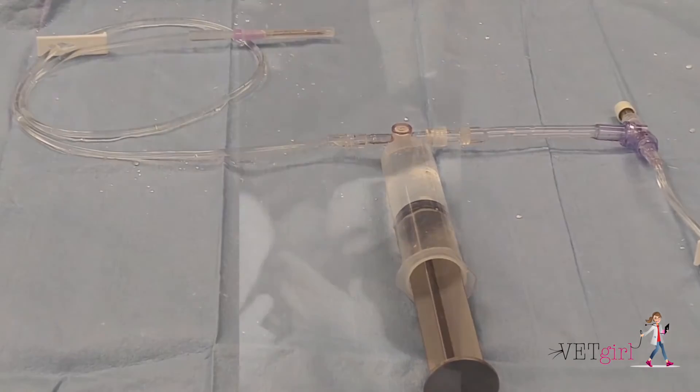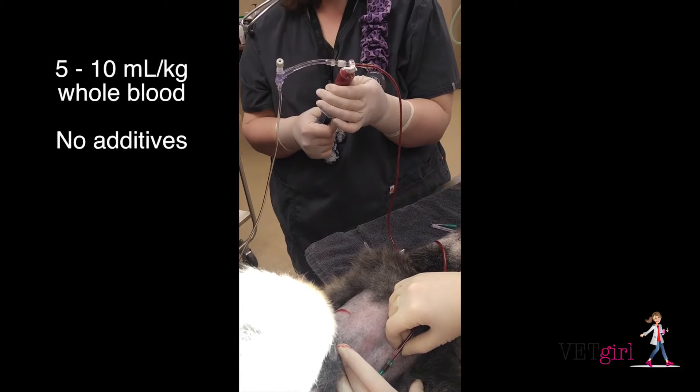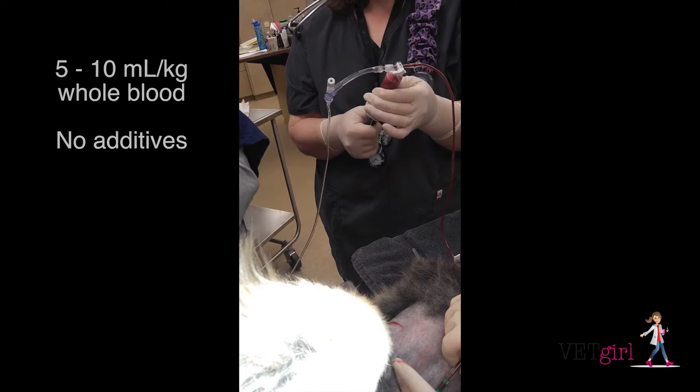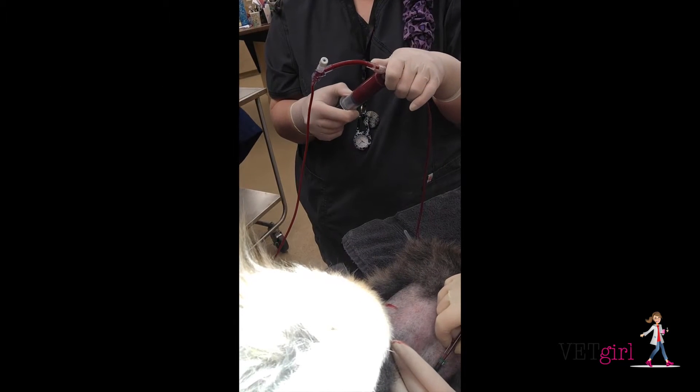Based on Oppenheimer et al.'s protocol, 5 to 10 mils per kg of blood can be collected in 20 to 50 mil increments and given directly via a previously placed thoracostomy tube or via thoracocentesis.